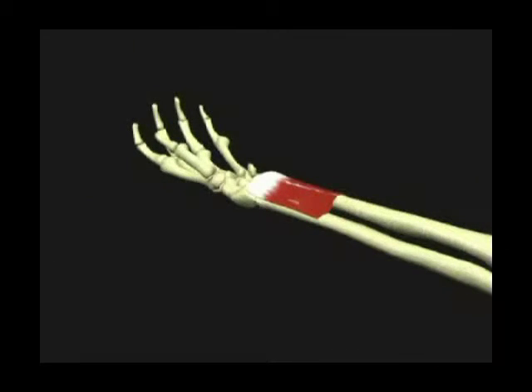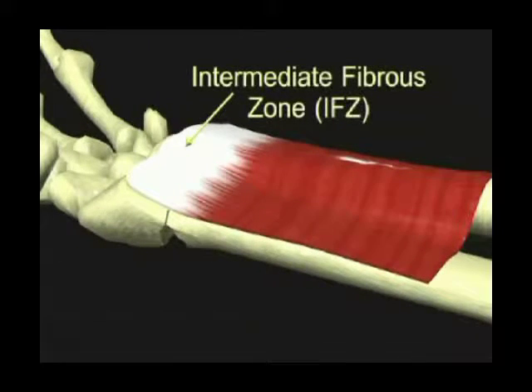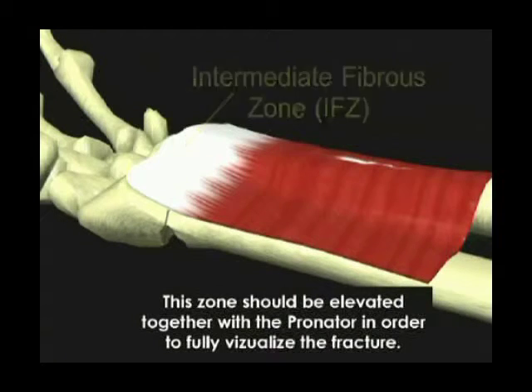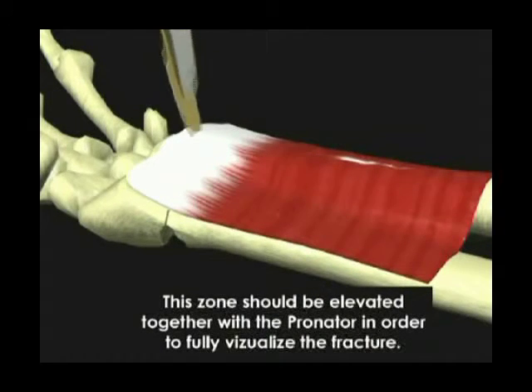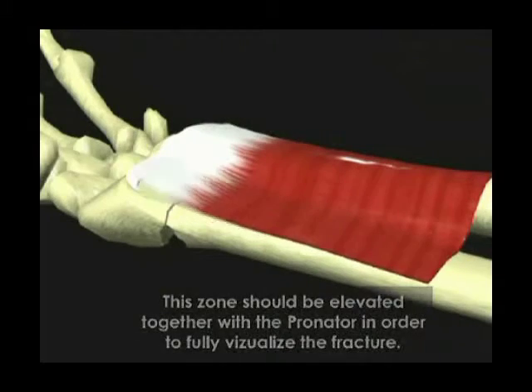The intermediate fibrous zone is a 1 centimeter band of fibrous tissue located between the watershed line and the pronator quadratus muscle. The IFZ should be elevated together with the pronator quadratus in order to fully visualize the fracture.